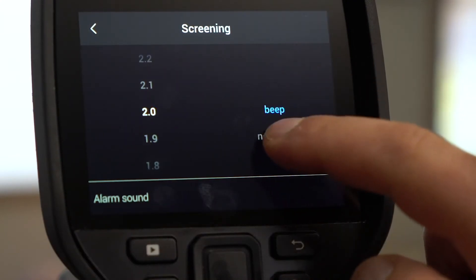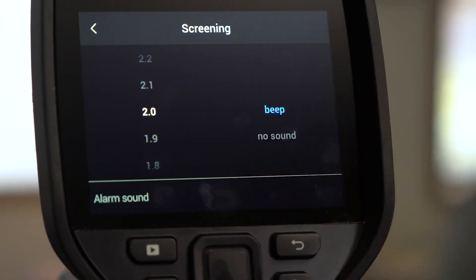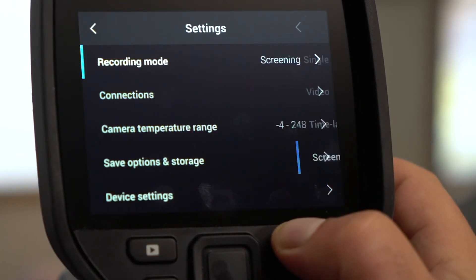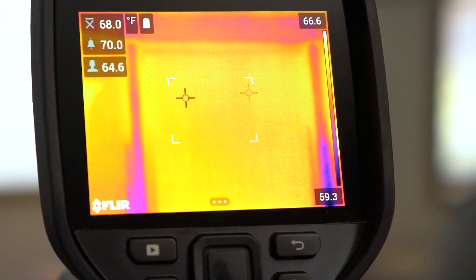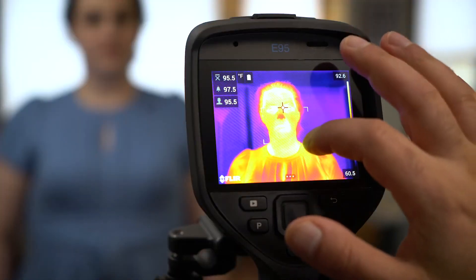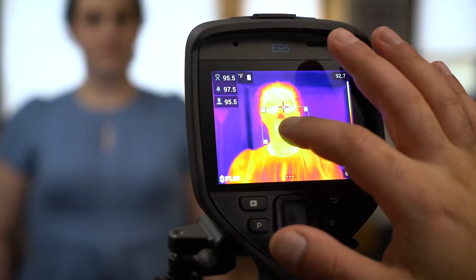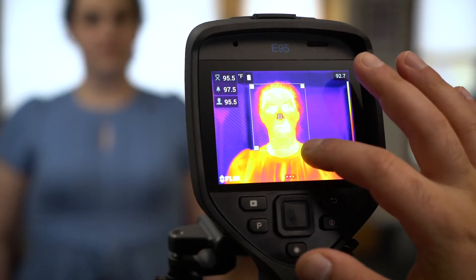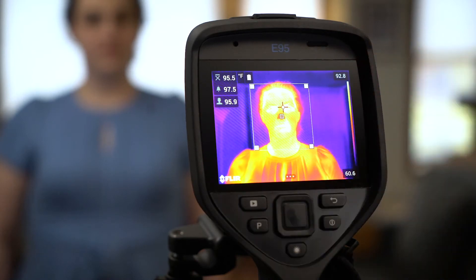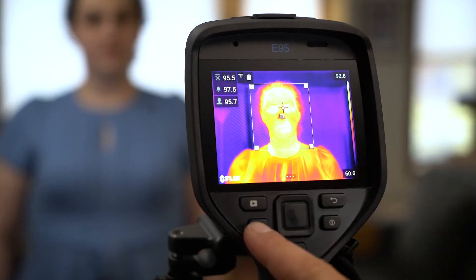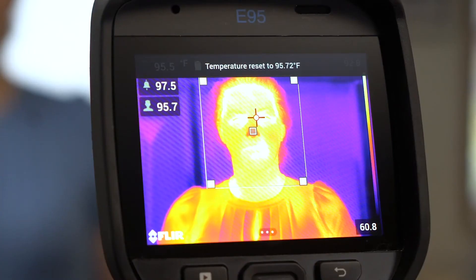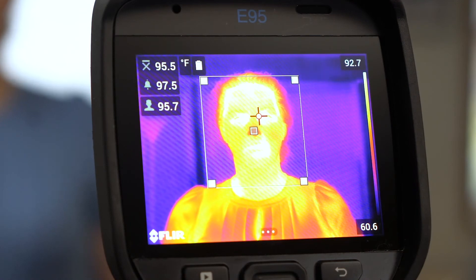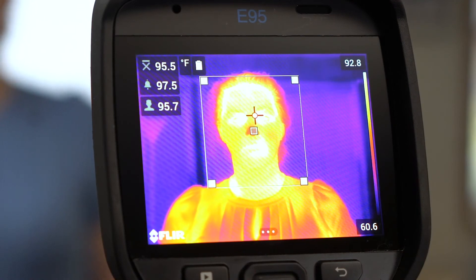You can also choose to turn the audible alarm on or off. Click the back button to exit settings. We'll set our baseline using a person whose body temperature is within normal range and placing the area of interest over our subject. Press the P button to set the baseline. The camera has now been set to alert us when it detects a temperature over two degrees higher than the baseline.